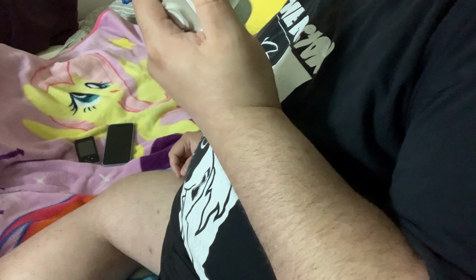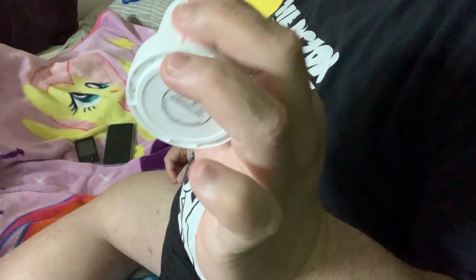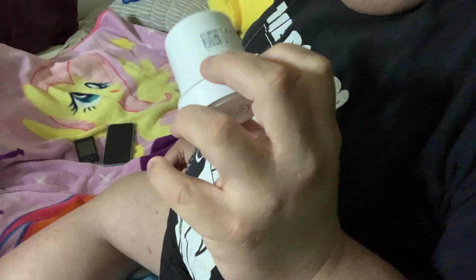I think this time I will probably be exposing the number for the receiver, and of course the number on the stabber, because you only can connect up to two devices. So if you guys see the code, I know it's kind of sensitive. I don't know if you guys see that for sure. But once I use that code, it's no longer available, so why not, right?